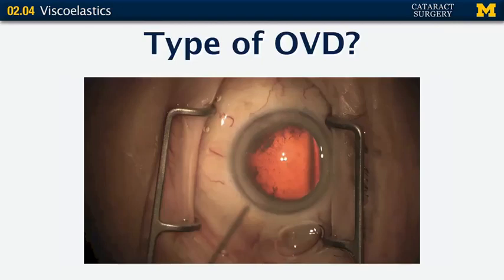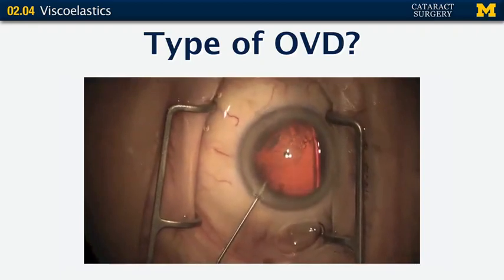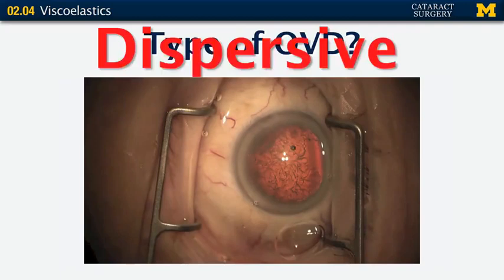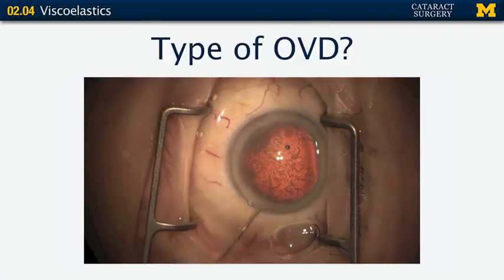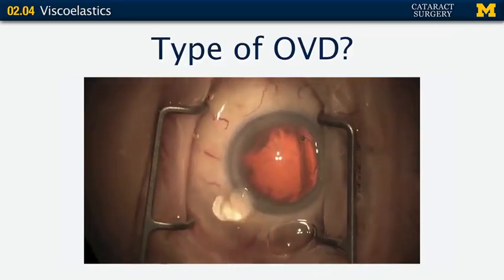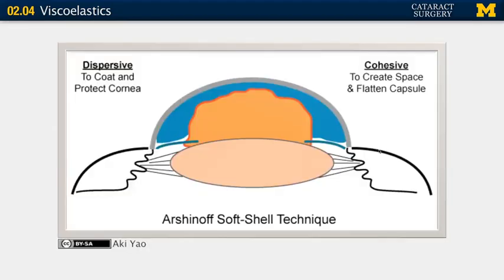Let's continue with the quiz using video. Tell me what type of viscoelastic agent you believe is being injected in the anterior chamber. If you said dispersive, you'd be correct — notice how it goes in in a squiggly chain-like manner and not as one big glob. As opposed to the cohesive, which goes in as one big glob. Usually a dispersive and cohesive agent are used together in the soft shell technique — the cohesive is injected after the dispersive to push the dispersive agent up next to your corneal endothelium, because the main object of the dispersive is to coat and protect.